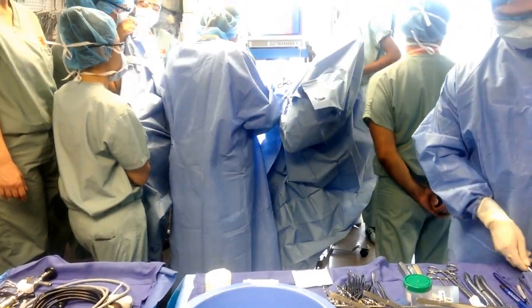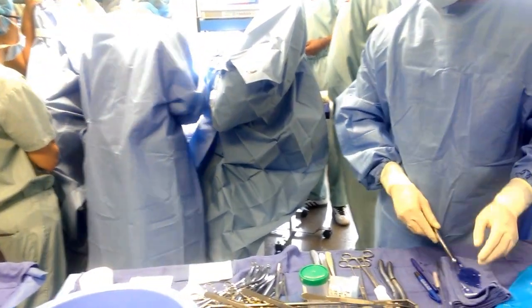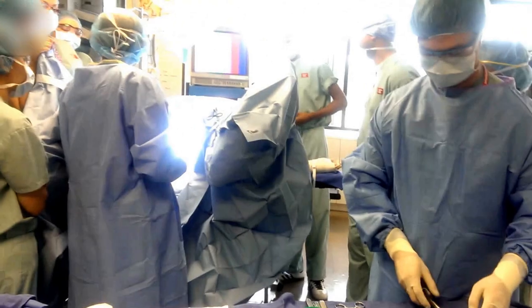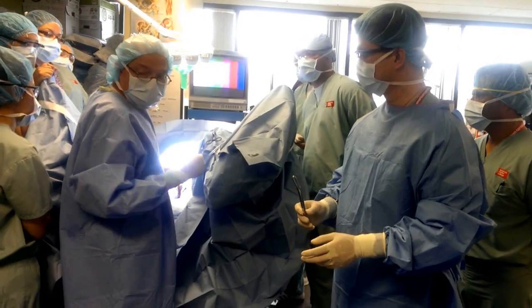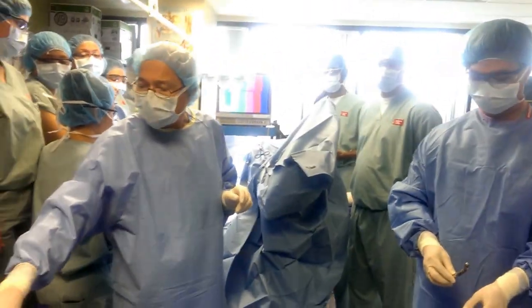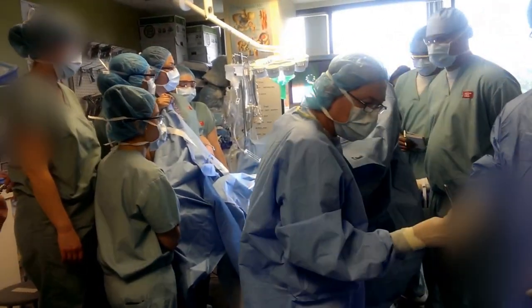Propofol. How do you know when it's time for the next one? It's for amnesia. Seriously, though, why does she never wake up? You're supposed to let it out. It's 12. Minutes? No, millimeters. How do you know when you're supposed to switch? Oh, you know, because you see the size of the resectoscope? It's at least 10 or 12, right? So I need to dilate it to that size. Otherwise it won't be able to get in. To go to the next higher.